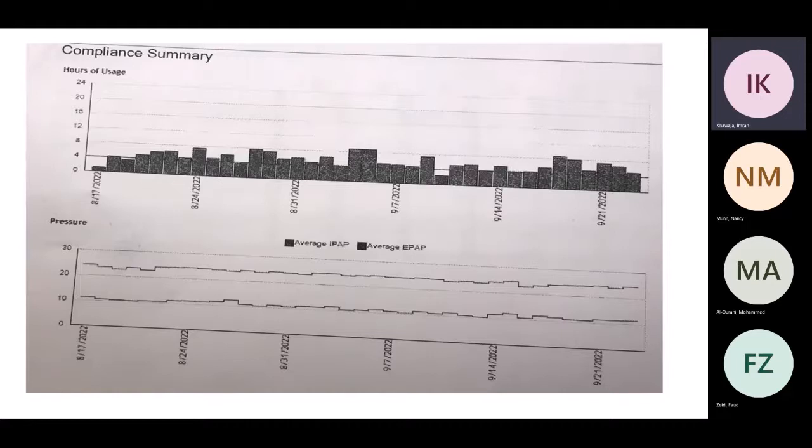I'll tell you something, forget IPAP when it comes to setting, because it gets confusing. It's not IPAP, it is the maximum pressure support. I'm talking about the maximum pressure support, which is 14. Yeah. So 14 plus 10, 24. So that means this is why the IPAP didn't go beyond 24. That's when you're looking at this page alone. And the next page is going to tell you what is the problem here. So this is a problem, by the way.